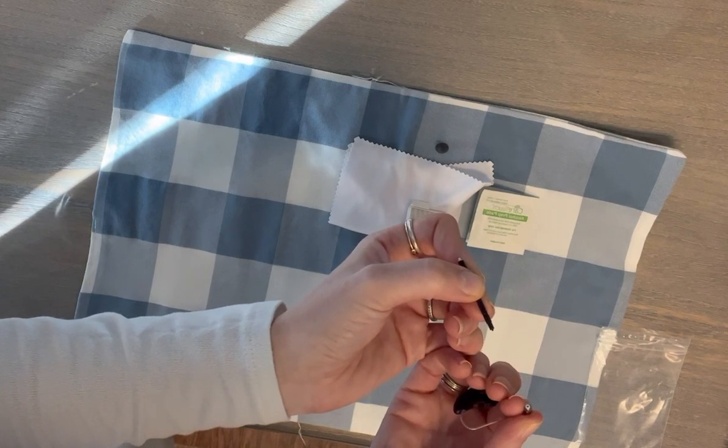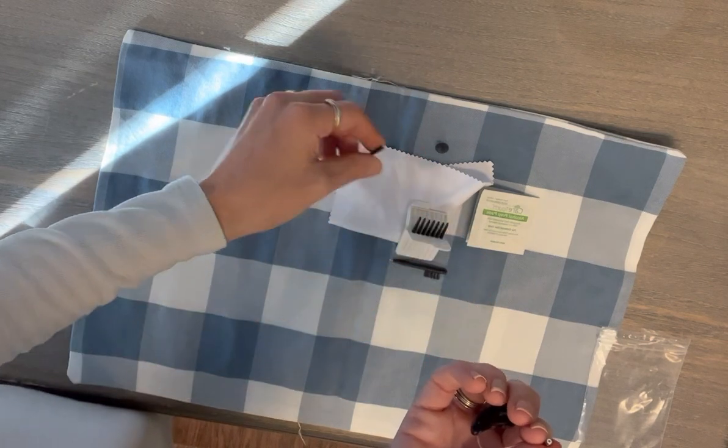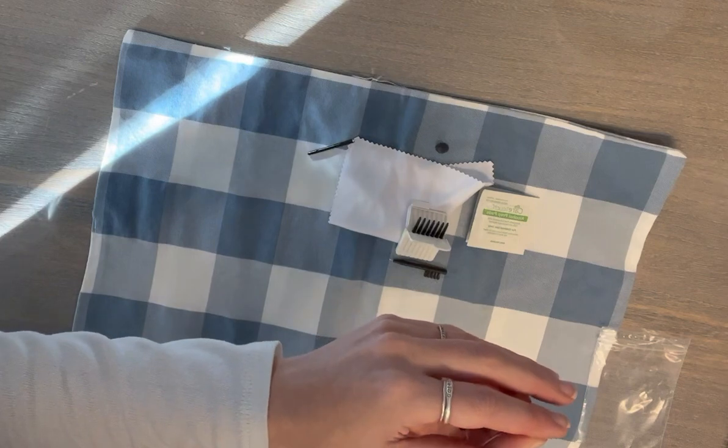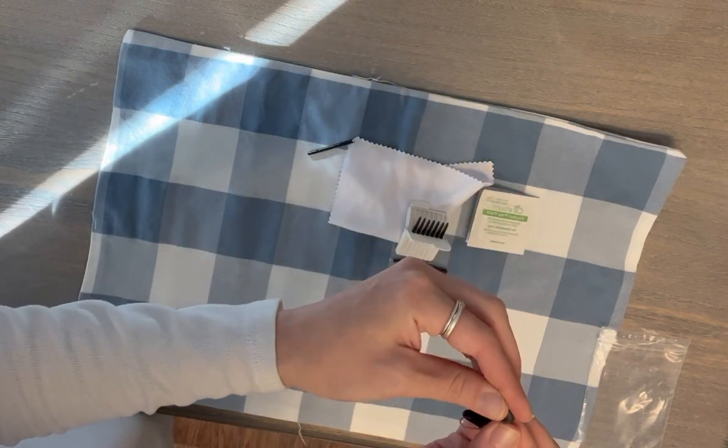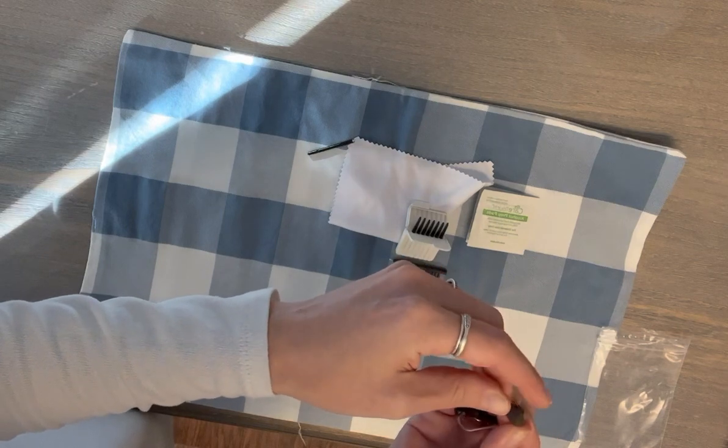And for most patients, this will be the easiest thing to tell that it will now work again. And you can put the tip right back on. And overall, that is the cleaning of the Signia.